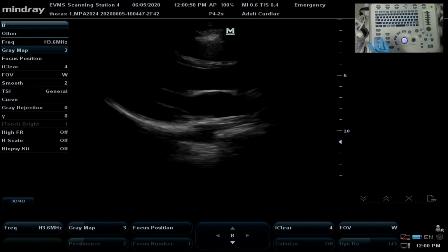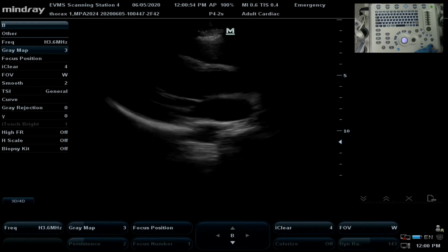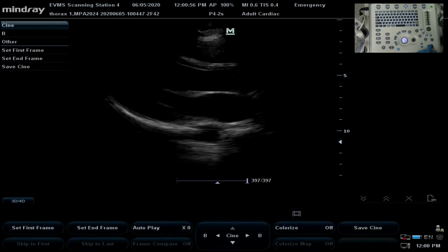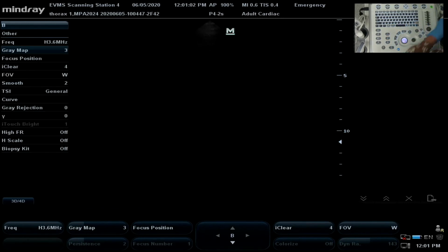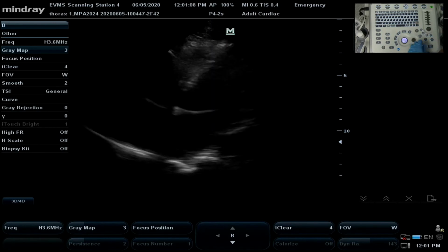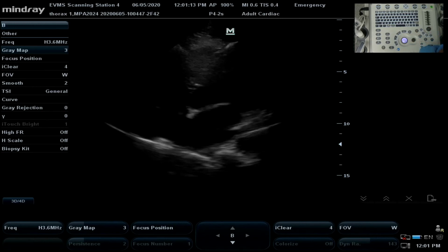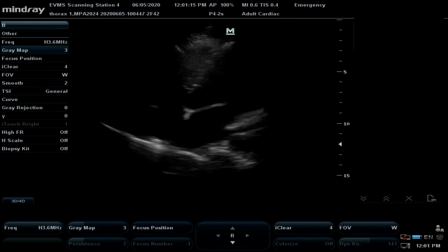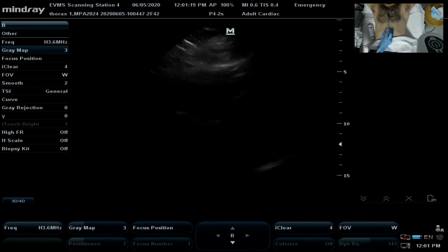I wouldn't go any further. I would have taken about 2 clips, 2 heartbeats, excuse me, saved my cine, and moved on. But I do want to show you that I'm gonna examine the apical 4 chamber. Let's just make sure I could use it. You could use it if it were required. And the one that all patients hate, subxiphoid.